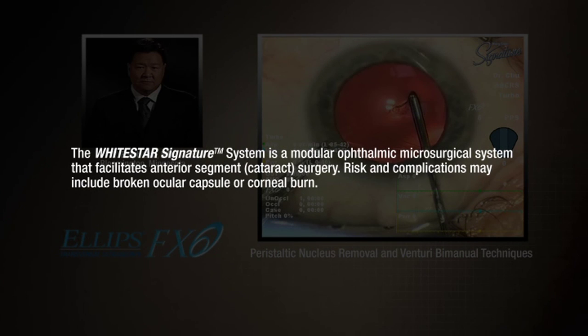The White Star Signature System is a modular ophthalmic microsurgical system that facilitates anterior segment or cataract surgery. Risk and complications may include broken ocular capsule or corneal burn.